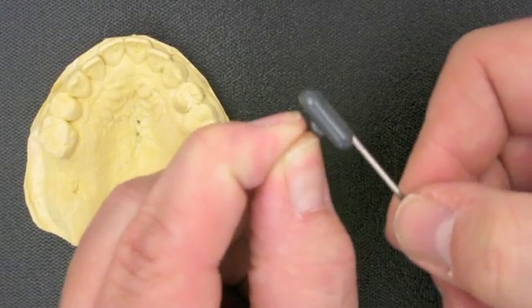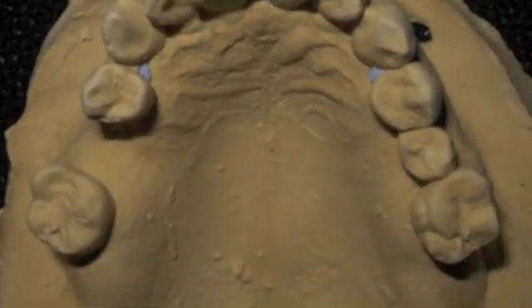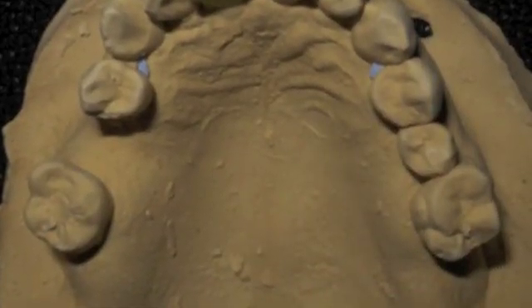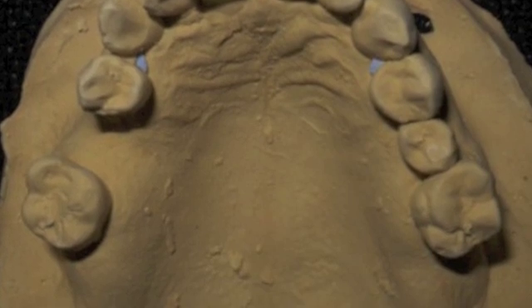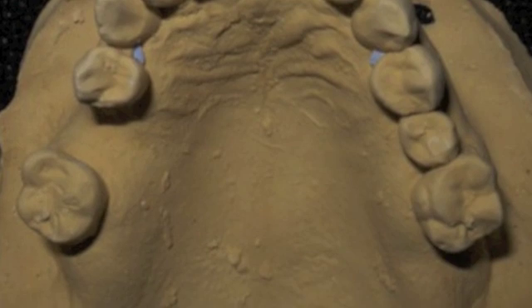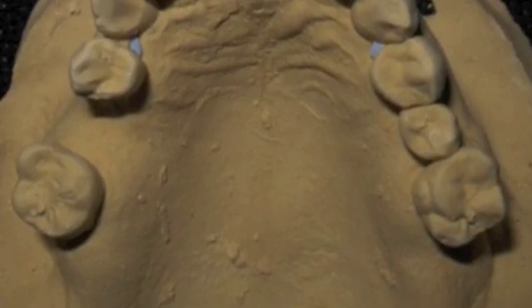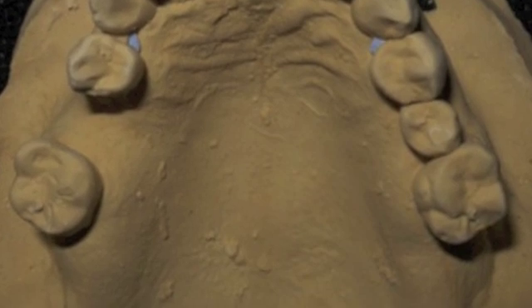So you need, again, two teeth. This actuator touches two teeth on either side of the nub. This patient had a very small upper left second bicuspid that did not allow the actuator to fit, and then the other side possible implant. The solution here is a crown on that upper second bicuspid or an implant in order for SoundBite to work.